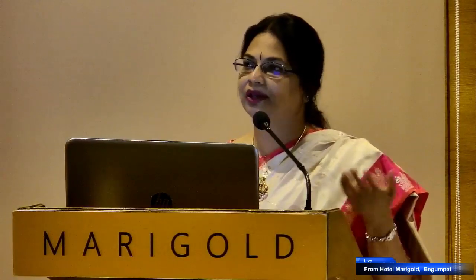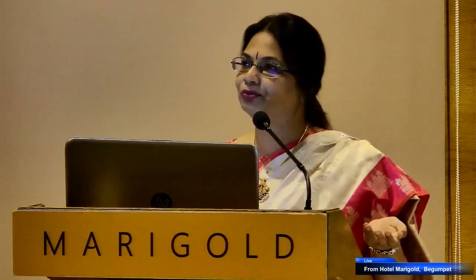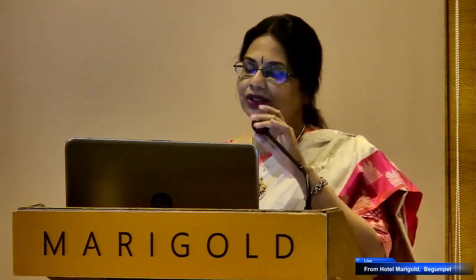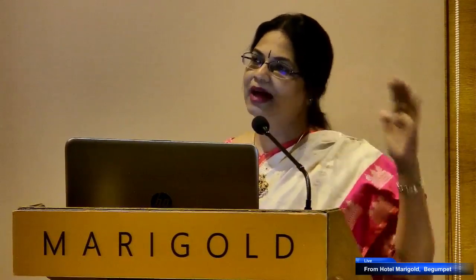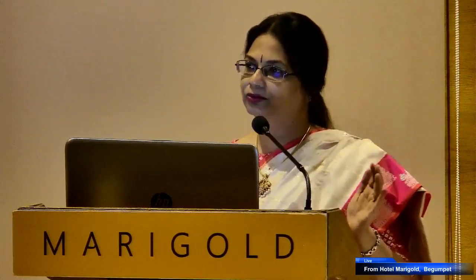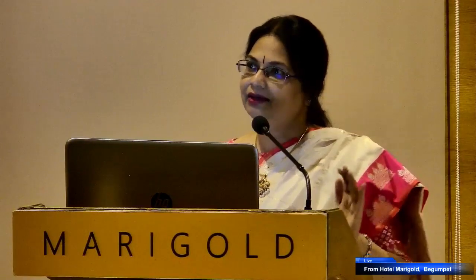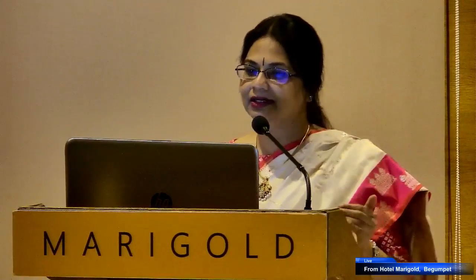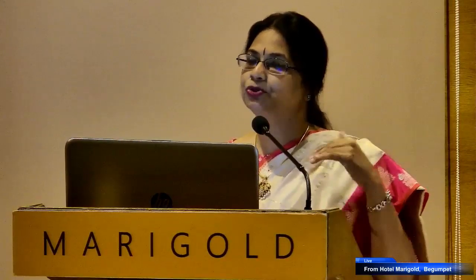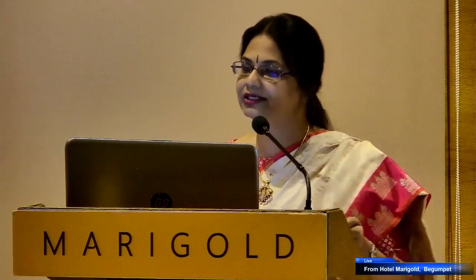Something like this where everything looks the same, everything looks so beautiful. What do you pick? How do you choose? So what we do is go back, track from where these embryos have come, look at the oocytes, see what link we can get, and then pick those embryos coming from better quality oocytes to improve our implantation rates, to improve outcomes for our patients.